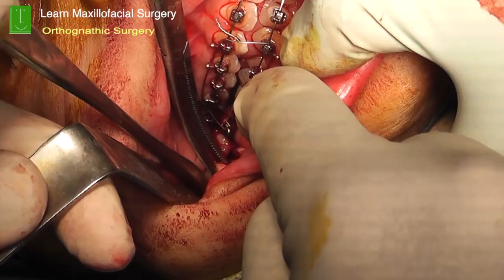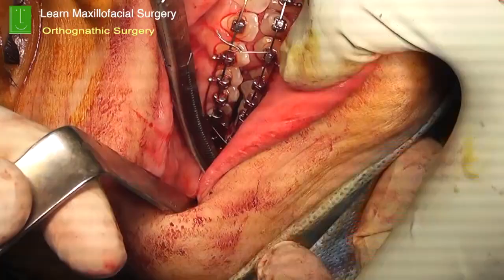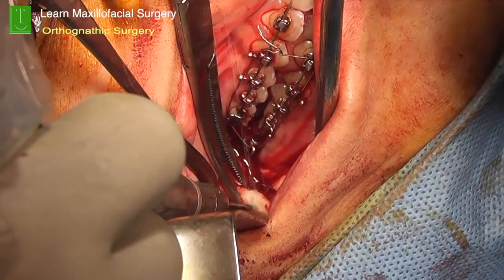So the other side also, you make your cuts in, take off that excess bone. A simple burr is good enough to make the cuts. Otherwise, you can use a reciprocating saw also. That's your personal choice. And that's where we are taking out about 6 millimeters of bone.